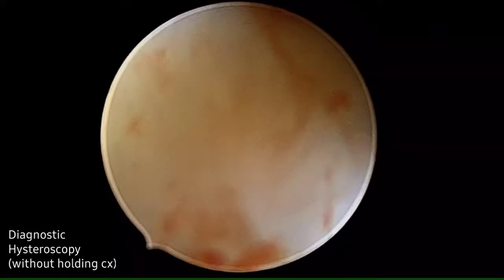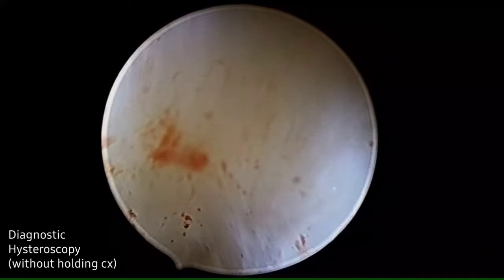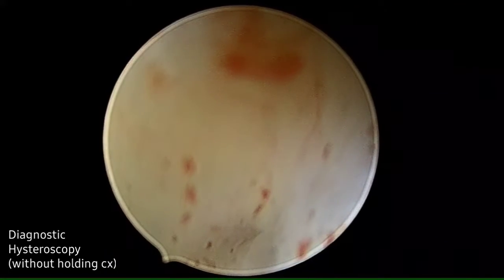false passage. Sometimes we don't find the way easily, so in that case we can wait a few seconds to let the saline enter the uterine cavity, and that also will help to find the internal os.